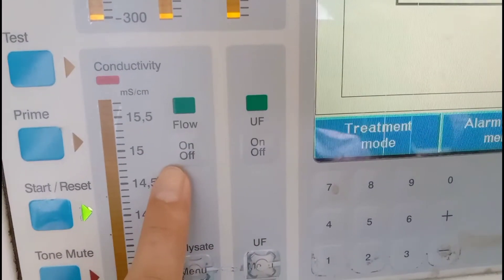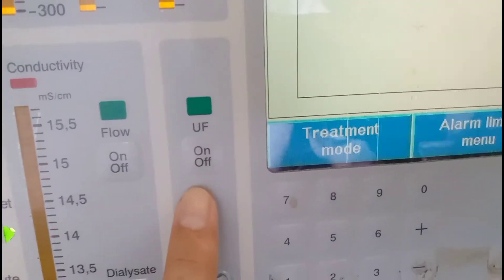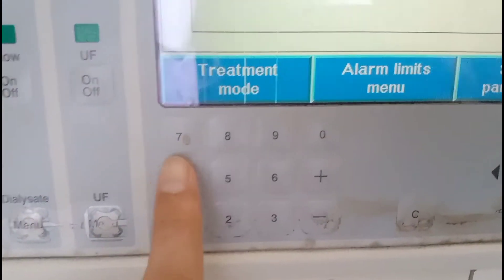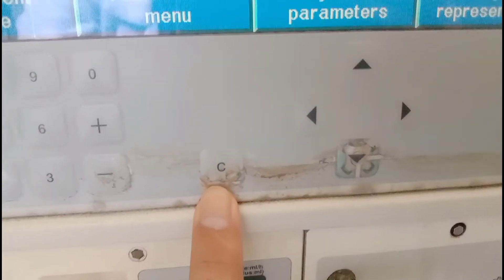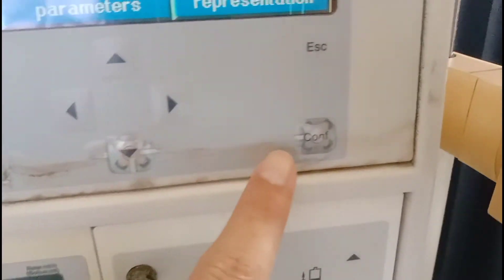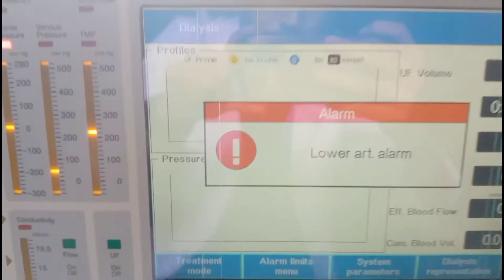There is a menu for dialysate, an ultrafiltration on and off button, and a menu for ultrafiltration. Here is the keyboard from which different settings can be input. Here is the cut key, these are the cursors, here is the confirm key, and it is the escape key.